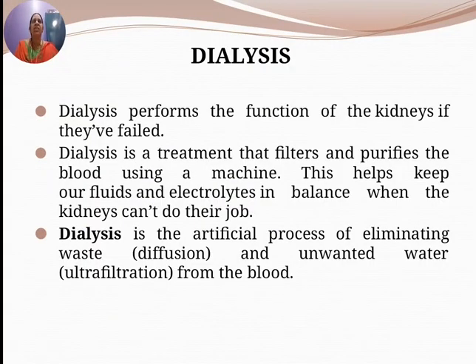So dialysis performs the function of the kidneys if they have failed. Dialysis is a treatment that filters and purifies the blood using a machine. This helps keep our fluids and electrolytes in balance when the kidneys can't do their job.